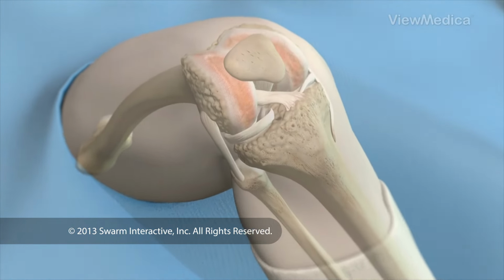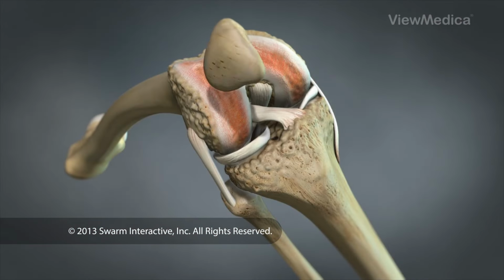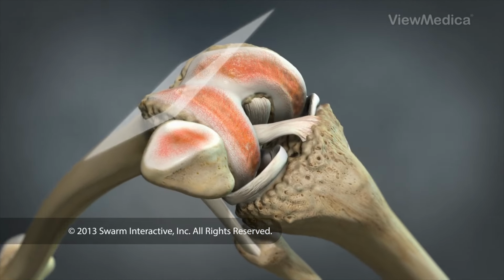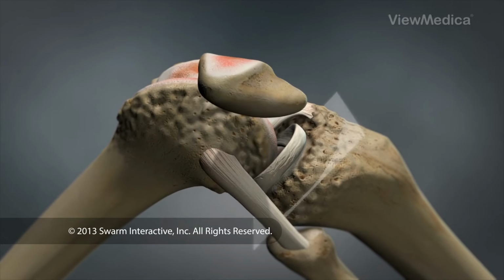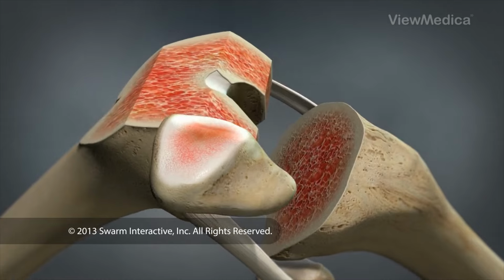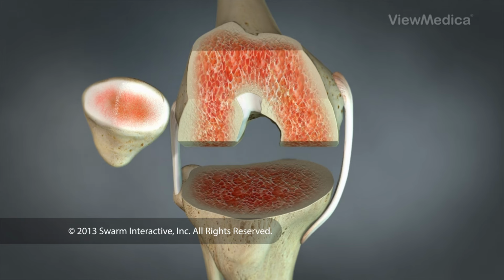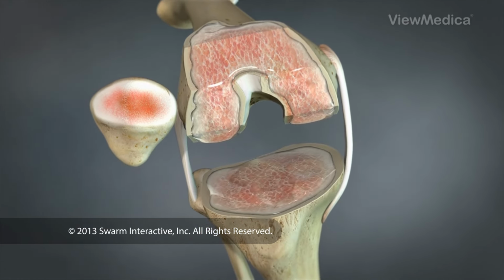The surgeon makes an incision in the front of the knee. The surgeon gently moves the kneecap out of the way to expose the joint. The surgeon carefully trims away the damaged ends of the femur and the tibia. The surgeon removes cartilage and a small amount of underlying bone, reshaping the bones to provide a stable platform for the artificial components. After the bones have been prepared, the surgeon may apply bone cement to stabilize these components.